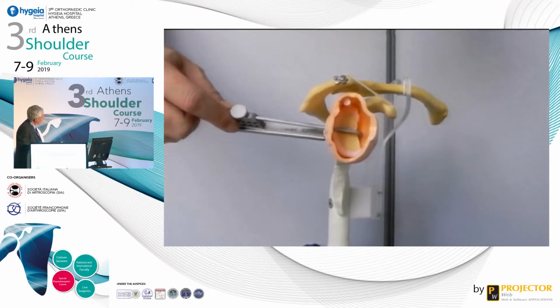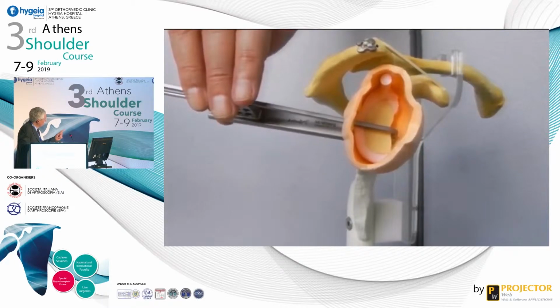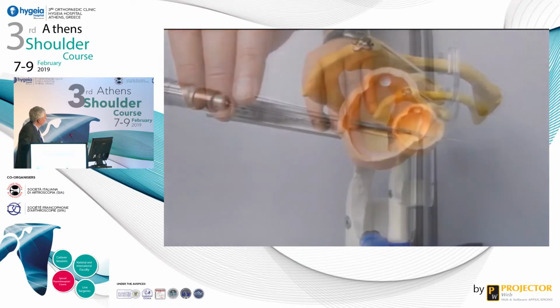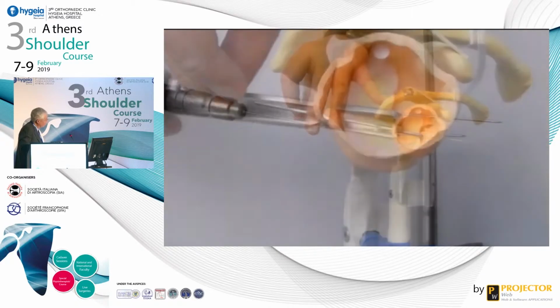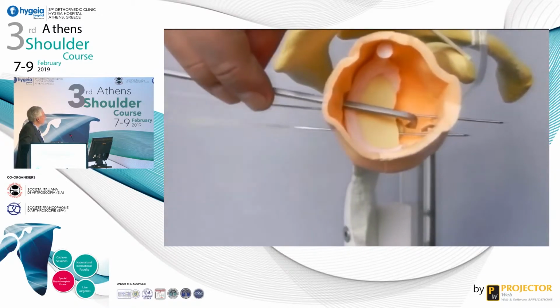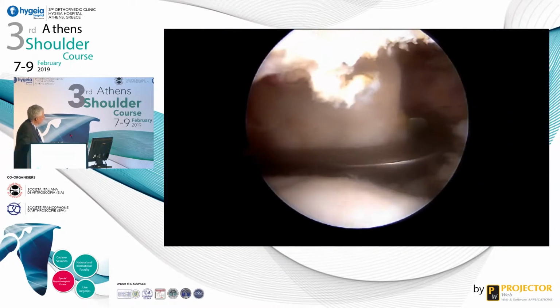We create a big bone defect, and you pull the first superior one in first. You pass a K-wire into the first hole, and after you create the second tunnel, you can remove it.